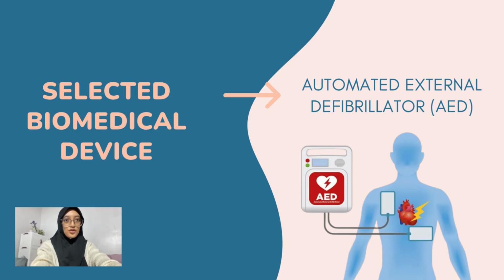The key reason we chose this device is that it clearly demonstrates the role of electrostatic energy storage. Inside the AED, a capacitor charges up to store electrical energy and then releases it rapidly through the patient's chest to the heart. This is a direct and life-saving application of the energy storage concept.